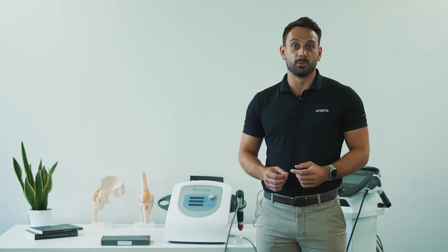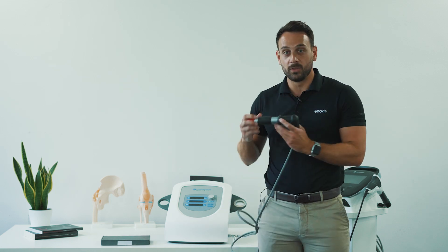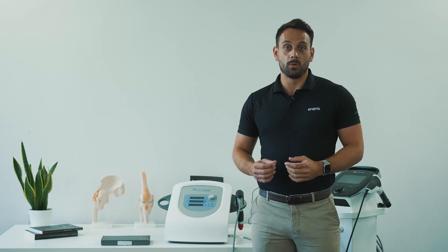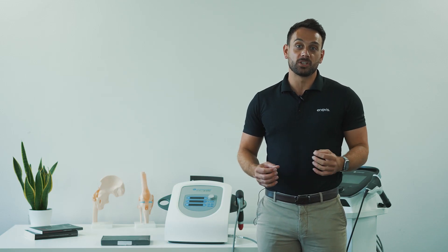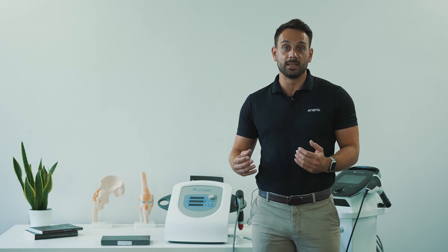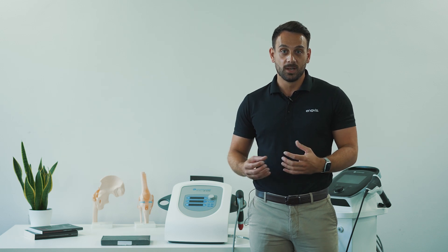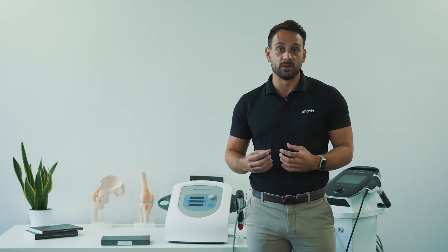Today we're going to be looking at how to perform a revision of the D-ACTA handpiece. The D-ACTA is found on the Mobile 2 RPW and original Intellect RPW devices. When your device hits 1 million pulses, we need to perform a revision of the handpiece. The reason for this is that we can guarantee that your first and millionth pulses will deliver the same amount of energy flux density into the tissue.